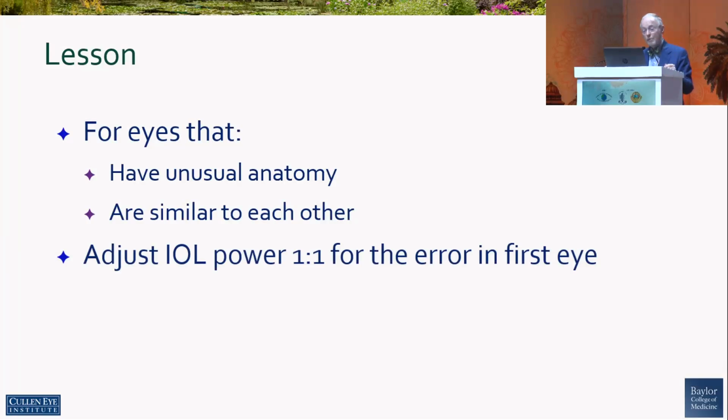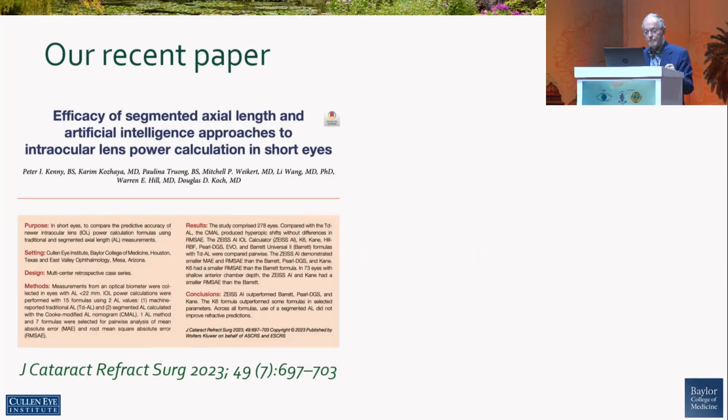That would have meant I would have had to aim for +2 in her other eye, which takes a lot of courage to do, but that would have given her a more accurate calculation.